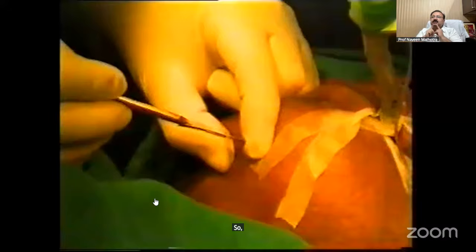So this is the mentum, its lateral edge. So a 1 to 1.5 centimeter incision starting from the lateral edge of the mentum, parallel and inferior to the mandible.